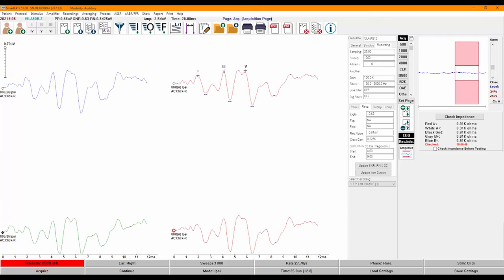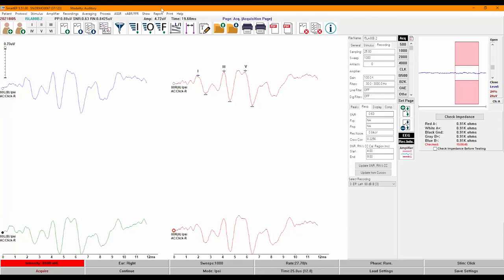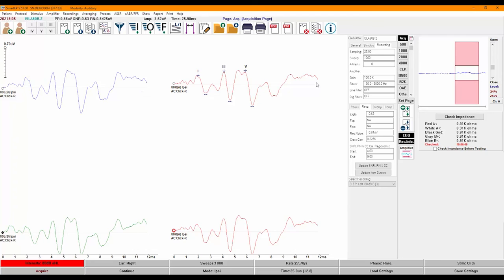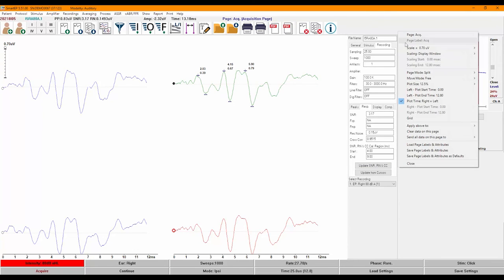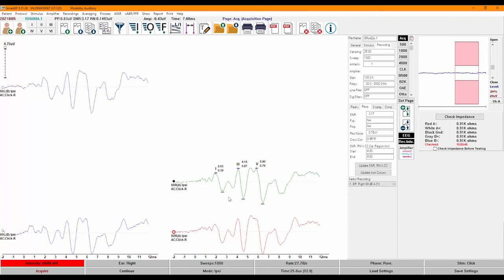You can easily zoom the recordings in and out using the zoom buttons — plus zooms in and minus zooms out. A horizontal baseline can also be shown for each recording and can be activated from the show menu. Another display option is the ability to show the latency and amplitude of a recording right on the waveform. For those looking for the cochlear microphonic, you may find it useful to set your display to start from negative 2 milliseconds. You can change the display time window from the Set Page menu or by right-clicking on your page.